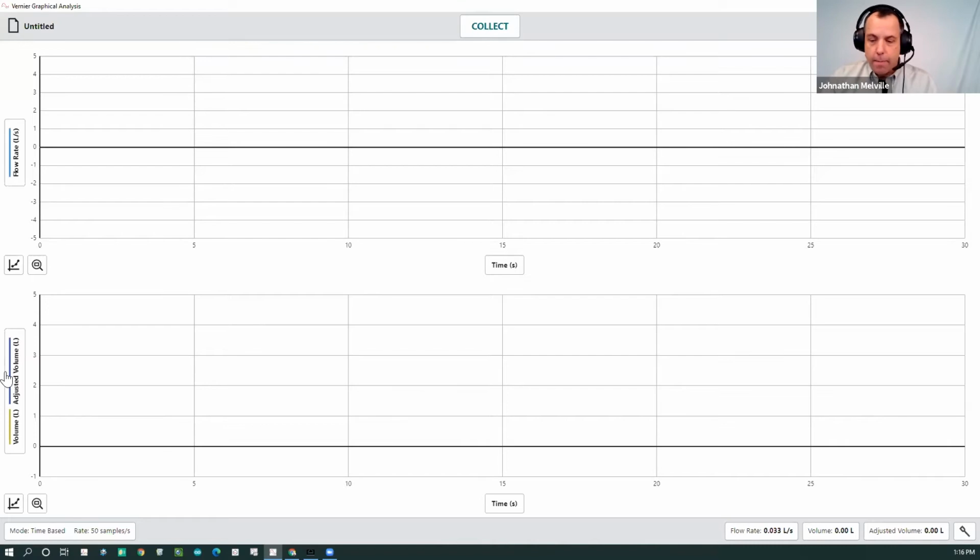The big thing to remember is you definitely do need to use a bacterial filter, which is actually pretty good at filtering out viruses too. If you're interested in that information, I can get it for you. And you need to use a mouthpiece. The mouthpiece is a key thing because you're putting it in your mouth. You don't blow on this like a horn. You don't do that. It has to go in the mouth.